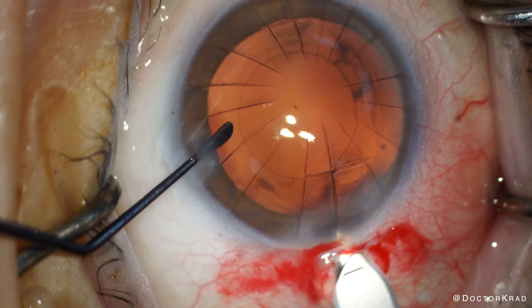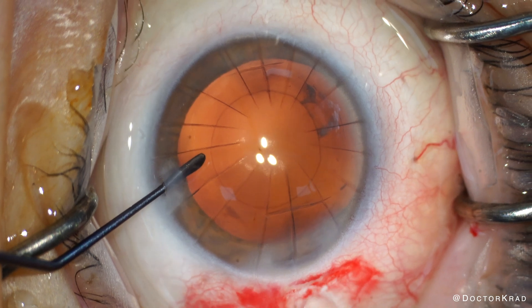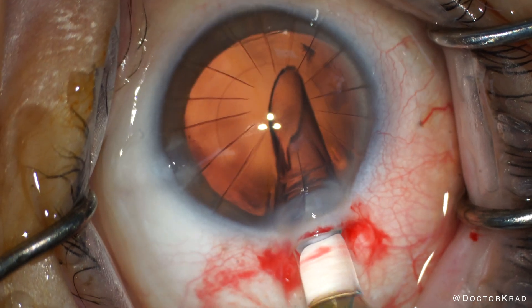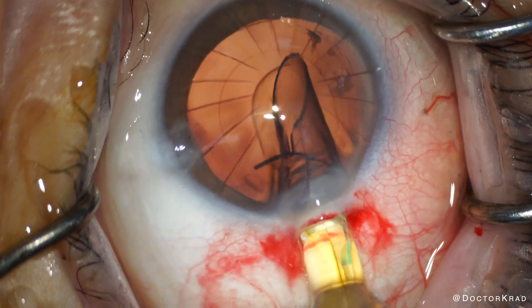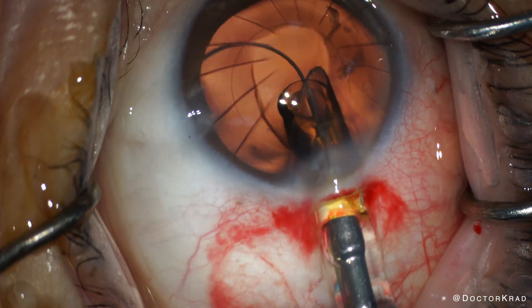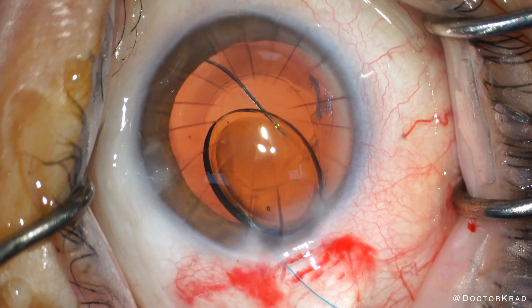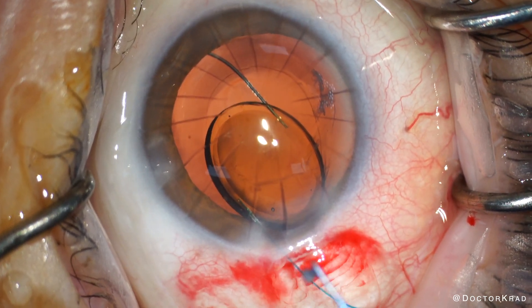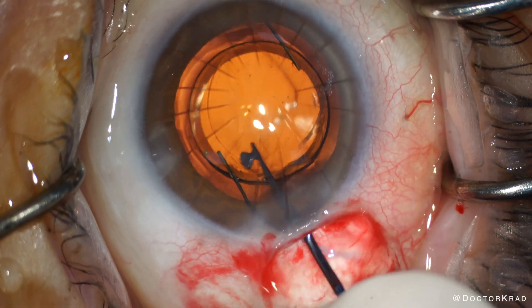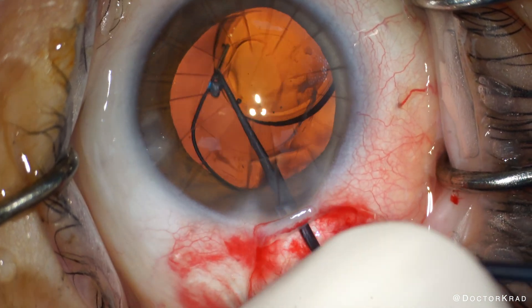How do I decide when to recommend a light adjustable lens, LAL, versus Apthera? Let's assume a patient is a candidate for both. If a patient has light sensitivity from their cornea and not their cataract, and a lot of fluctuating vision — maybe irregular astigmatism — I would lean towards the Apthera. Although the LAL is more likely to eliminate their residual refractive error and help with potential refractive surprises, it's not going to address fluctuating vision or light sensitivity from the cornea. In this patient, we chose the LAL.